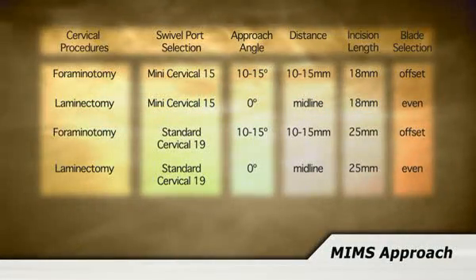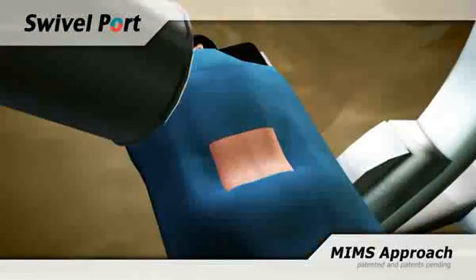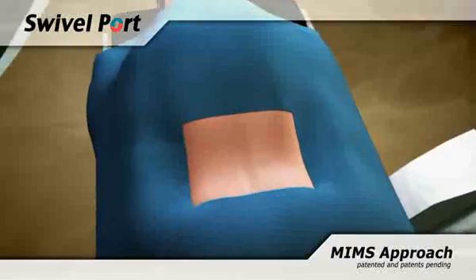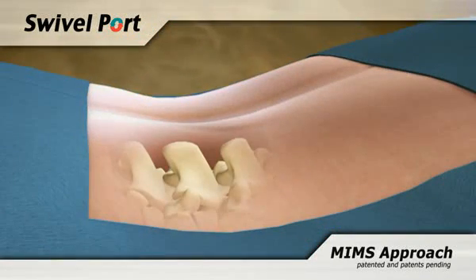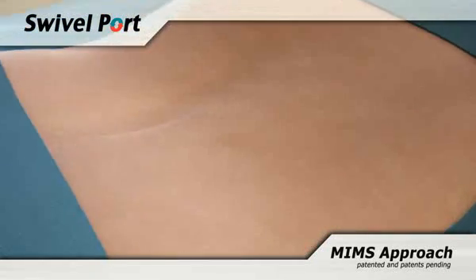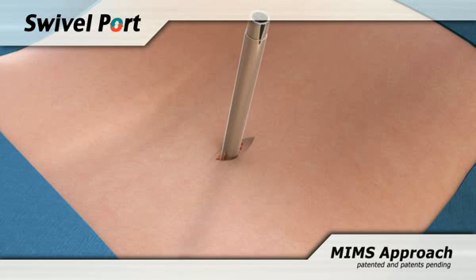For this product overview, we will show how the swivel standard port is used to perform a T-LIF procedure. Like all procedures, confirm the level and trajectory of approach by spinal needle and fluoroscopic imaging. Access to the spine is gained by either using dilation to create a wound channel, or making a small 15mm incision in the skin and splitting the paraspinal muscle.